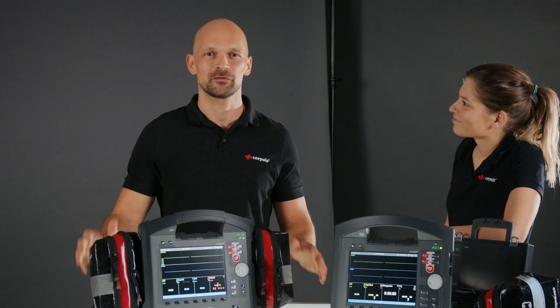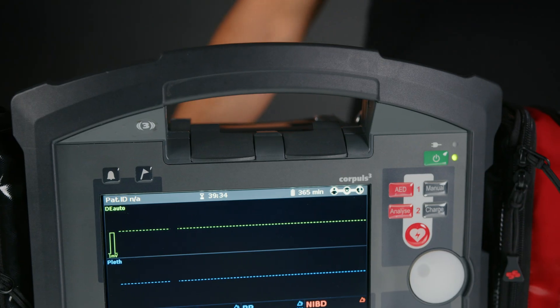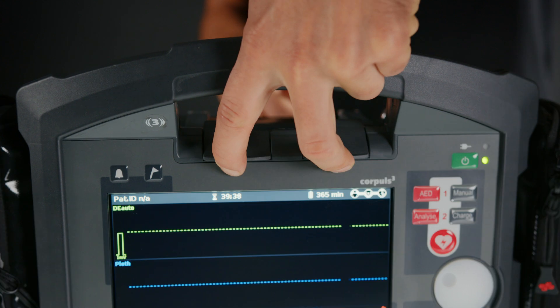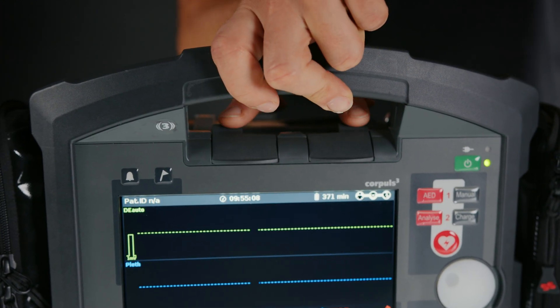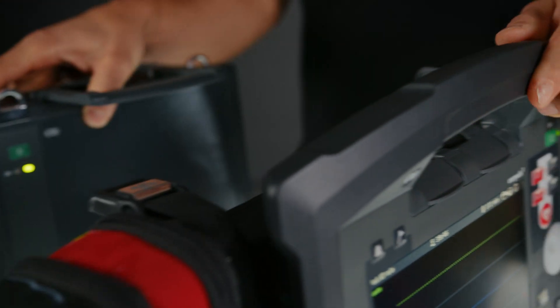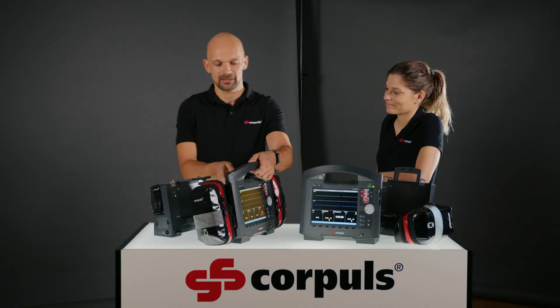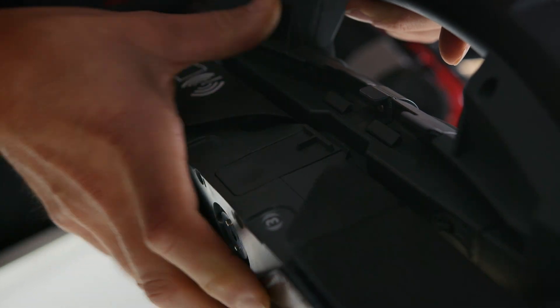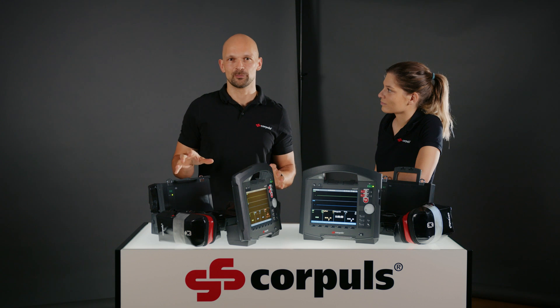Sure. In compact mode, the three modules are connected via infrared and electrical contacts. To separate the modules from each other, you can use the snap lock at the front. I can either pull it towards the display or press it from the back, and can then detach the display and the patient box from the defib module. Pressing the second snap lock at the back of the patient module releases it from the display.